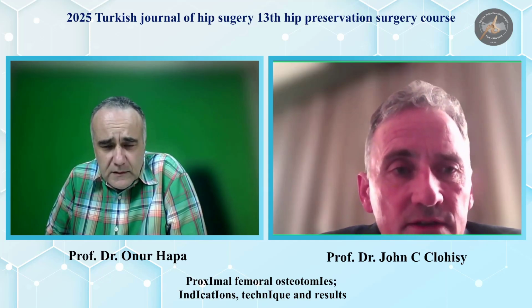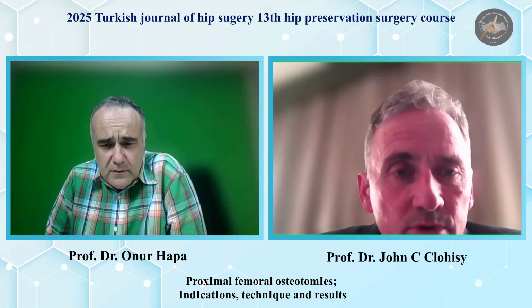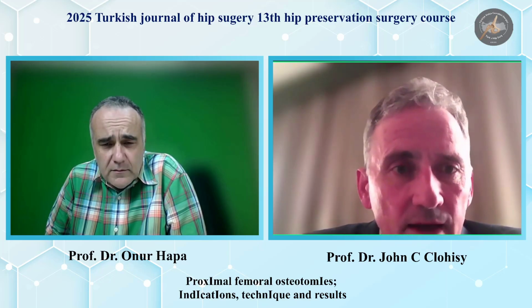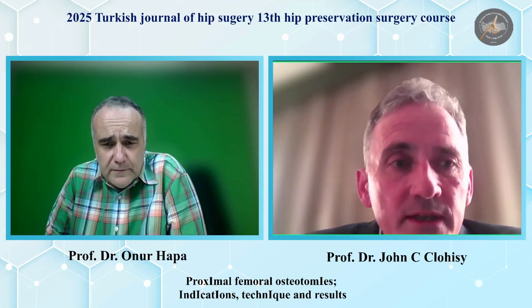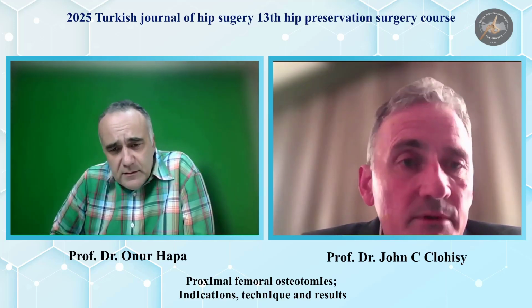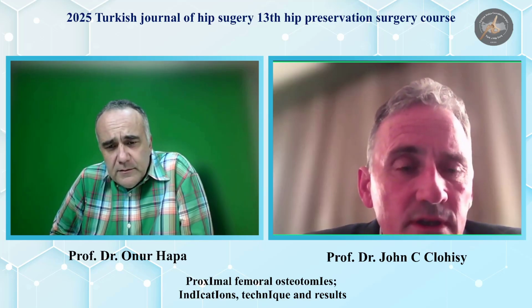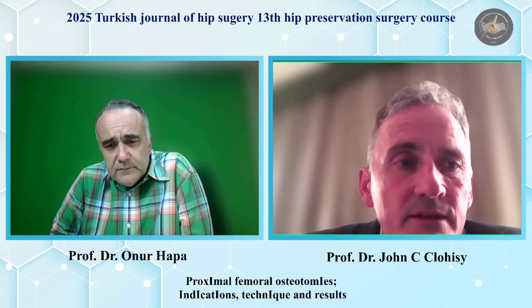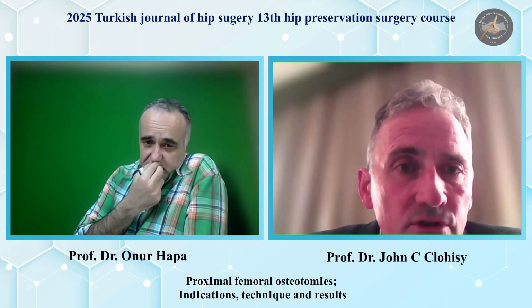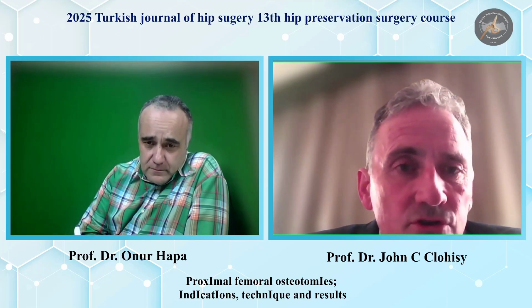A lot of these hips, the anterior superior greater trochanter impinges. So we take down the anterior superior greater trochanter. Sometimes the inferior spine impinges. We take down that. And then we examine the hip intraoperatively. And if it's still problematic in terms of the extra articular impingement or the range of motion, then I do a combined derotation of the femur. And that would be through the surgical dislocation. I just extend it distally and do a derotation like I showed you.